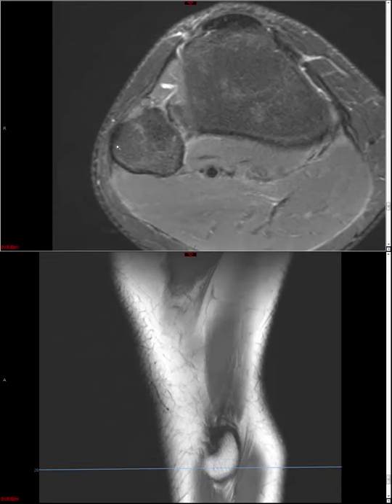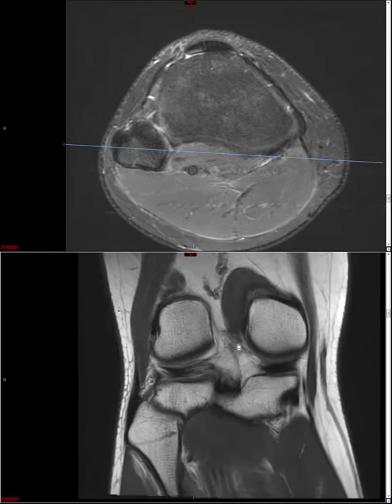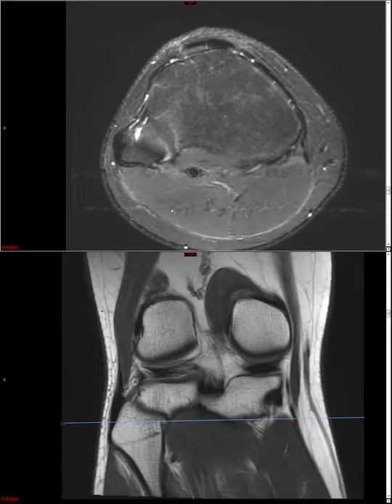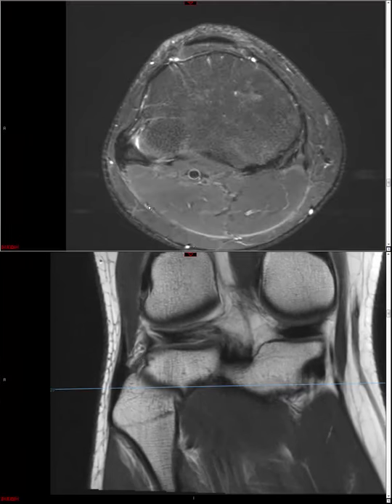So if you're looking at a plain film and you see an avulsion fracture, you can actually deduce if it's involving the LCL slash biceps femoris by where the defect is on the fibular head. There are other structures, secondary ligamentous stabilizers, that insert more either on the tip of the fibular styloid or at least more medial to the biceps femoris LCL insertions. But we won't go over too many of those today. I think for your first run through a knee MR, it's not critical, but just because it shows so nicely, this, by the way, is the popliteofibular ligament. Again, that's just FYI at this point.